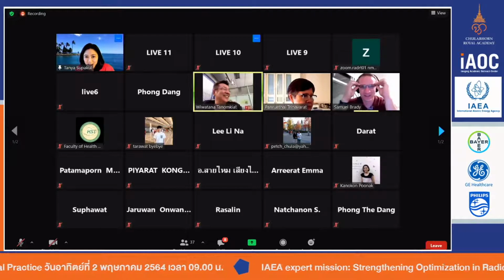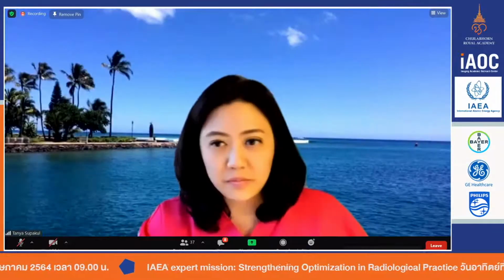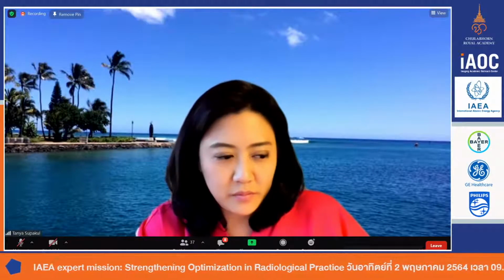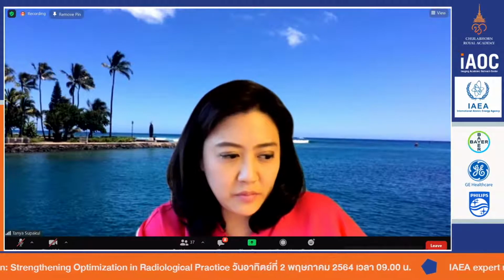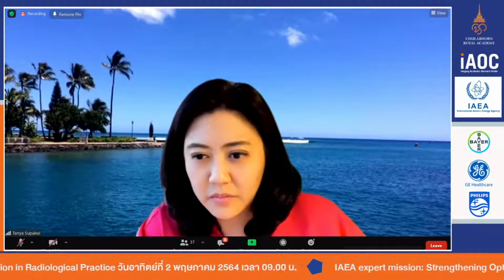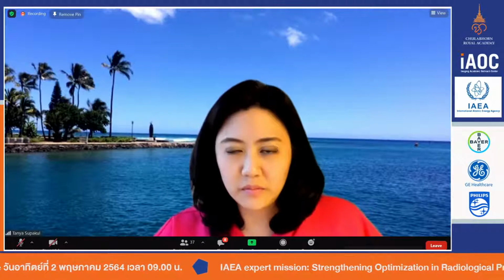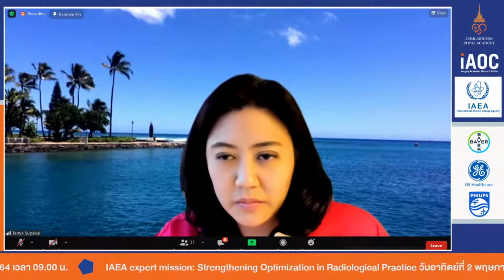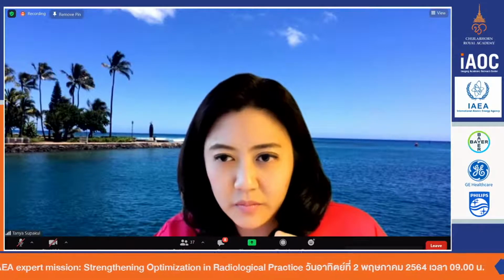The question was, how can we improve imaging, especially in the field hospital where we're looking for subtle findings? In this case, these patients, as you mentioned, are asymptomatic, so they're most likely ambulatory. They're probably people we can talk to. We can ask them to hold their breath, so we can image them in an ideal situation. I don't know exactly how you're doing it, if the mobile unit will come to them or if you've set up one location and they'll go to it.